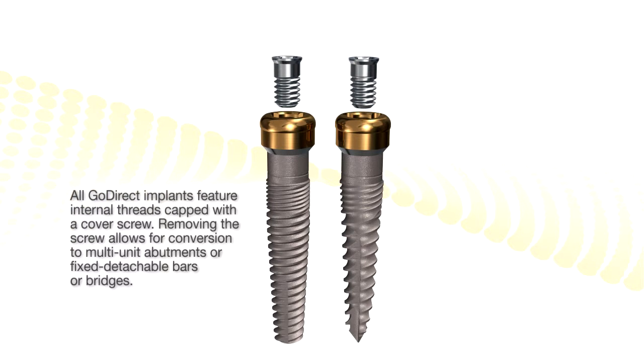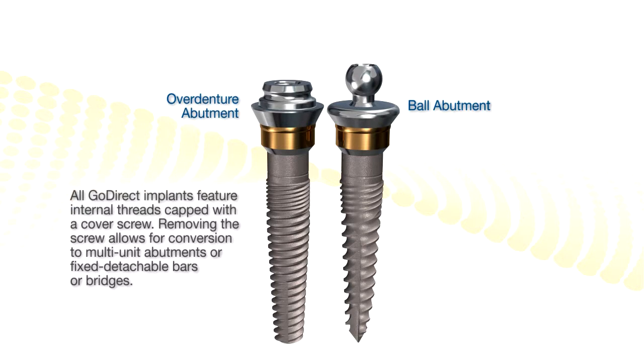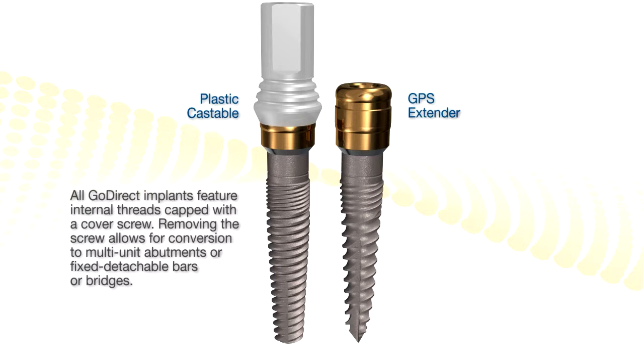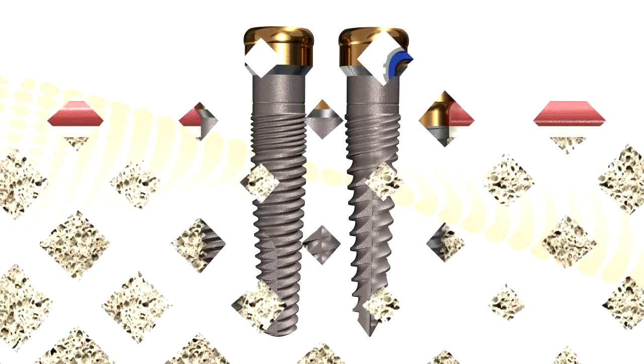They both come with an internal set screw that can be removed so that you can add a multi-unit or a ball abutment to it. You could add another GPS extender or a custom cast abutment to it. So it's a one-piece implant that can be converted into a 2-piece.